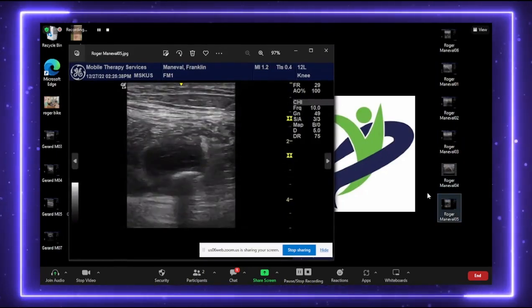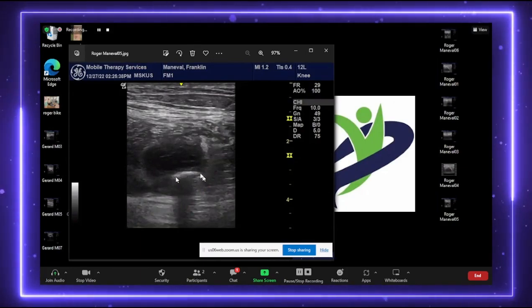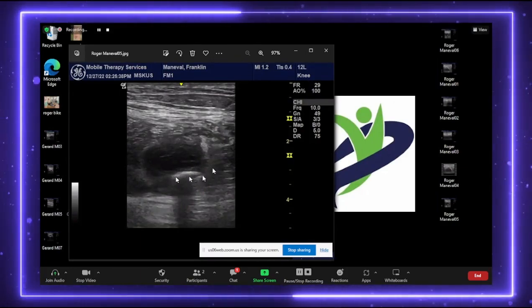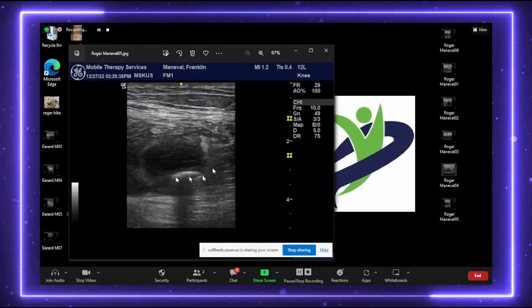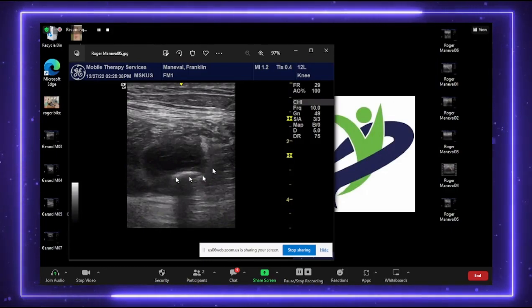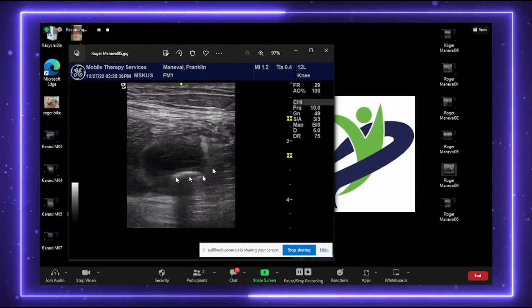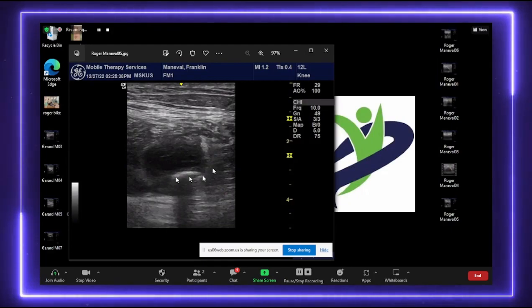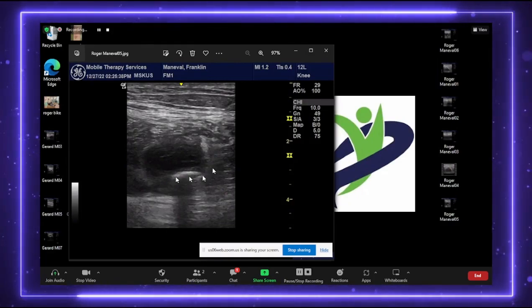And we have another short axis view of where the semitendinosus would be with, again, an avulsed bone fragment from the ischial tuberosity. Believe it or not, this gentleman has no pain. He had a full thickness tear of the semitendinosus with retraction and a bone fragment that did come off with it. He's pain-free. We are still working on his knee range of motion. If I never ultrasounded him, he never would have known he ruptured the tendon.